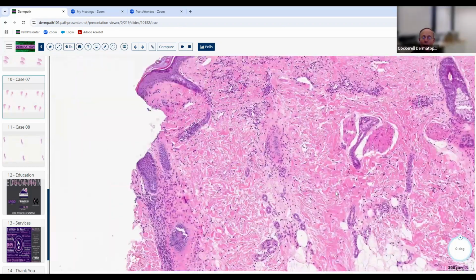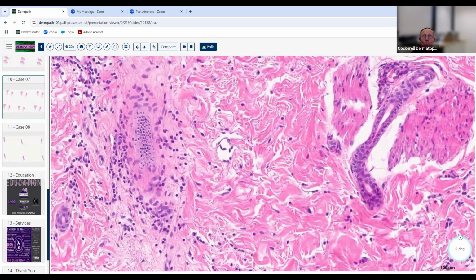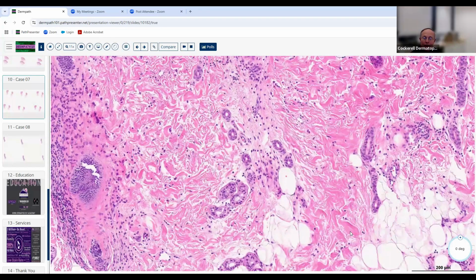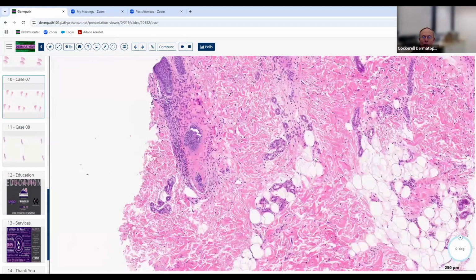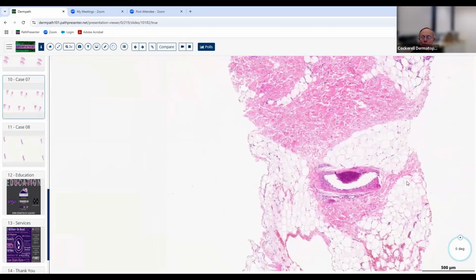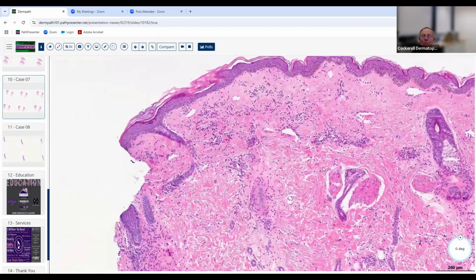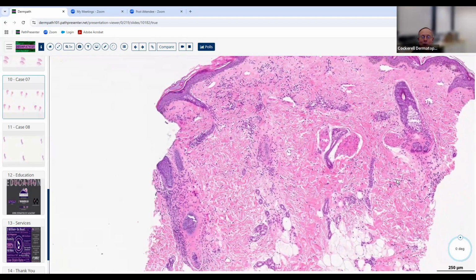So now what are we beginning to think about? We don't see a lot of sclerosis in here, but we're seeing some incipient changes, where we're losing some fibroblasts. We're beginning to replace some of the fat here, possibly. We've got a markedly thickened septum down here that shouldn't be there. This isn't an easy one. It'd be boring if they were all easy for you guys.